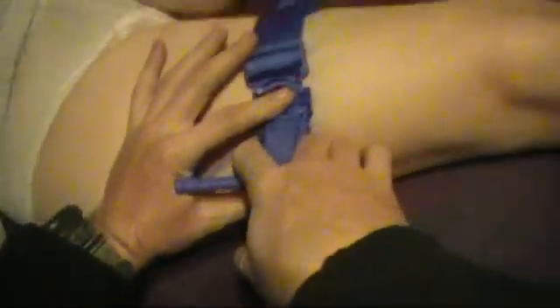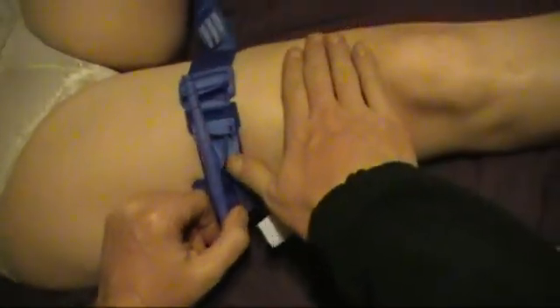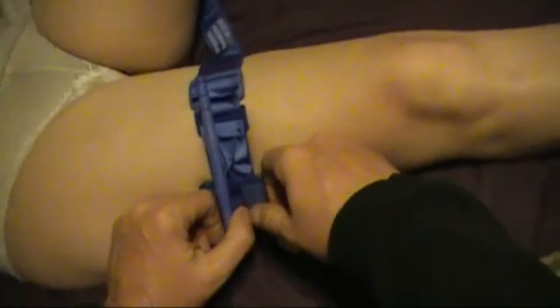Okay, tighten this up, then you're going to pull out the slack in the windlass, as I'm just going like this, pulling it tight. And then you're going to crank the windlass down. Now, I'm just snugging it up so it doesn't move. But you would continue to crank this windlass until the bleeding stopped. No more bleeding, you can stop. Still bleeding, keep cranking it. Yes, it's going to be a lot. Yes, you are really going to be tightening this thing down.